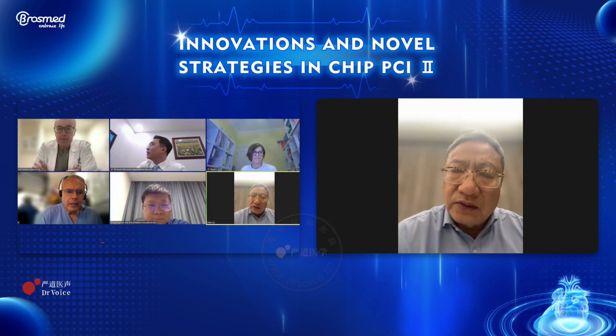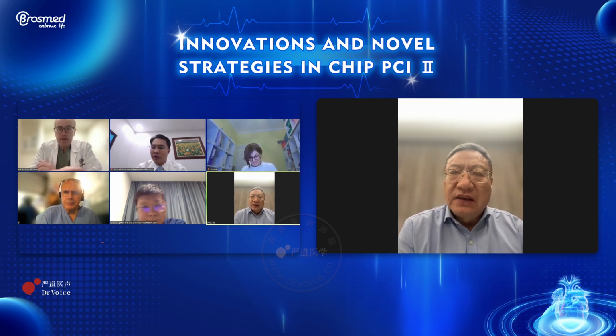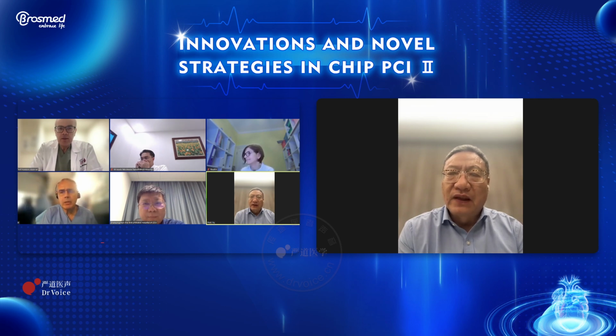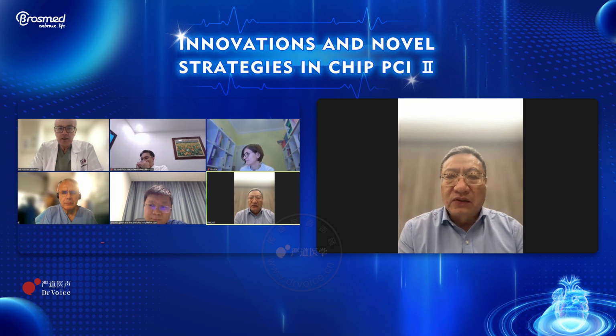In our clinical experience, if patients don't get a stent after primary PCI, some of them with reasonable lesions will be occluded again in a very short time. So in your cases using the drug-eluting balloon, how high is the incidence of reclosure during the hospital stay?